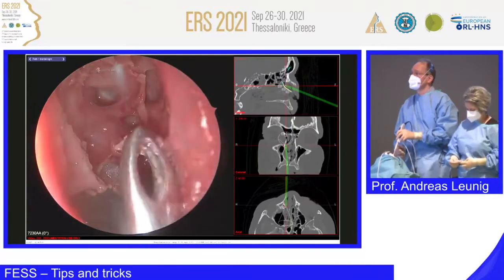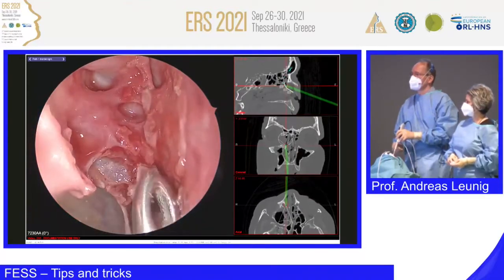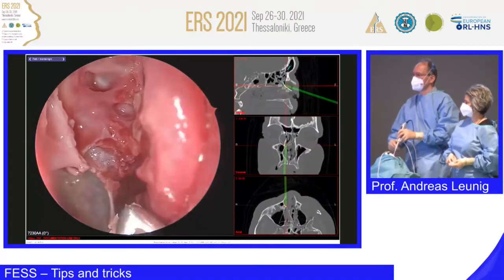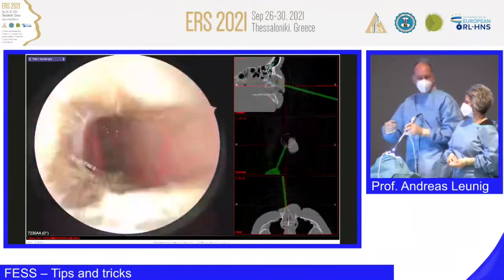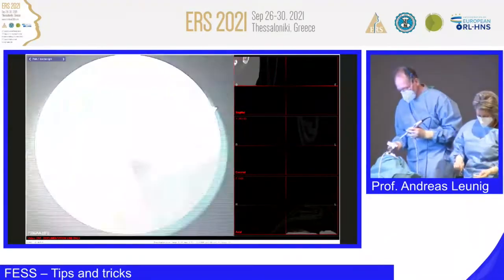Okay, so let's say you get to this point in the operation, Andreas, and it's all gone pretty smoothly up till now, as beautifully as you've dissected it, and then you start getting some troublesome bleeding. What do you do in those circumstances? Oh, I blame the anesthetist. I say, oh, well, fix it. Yeah. Fix it.